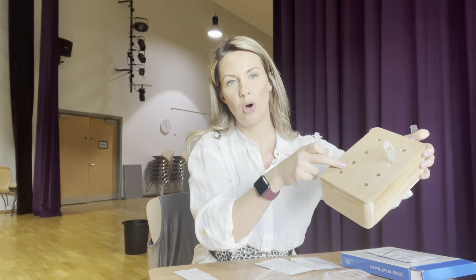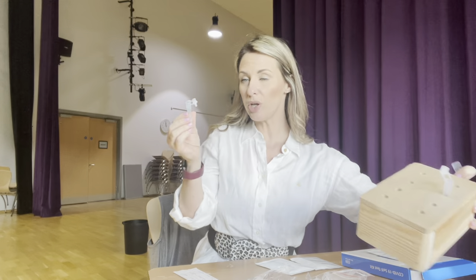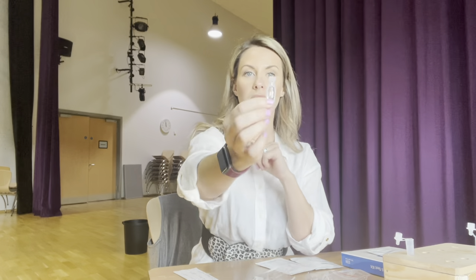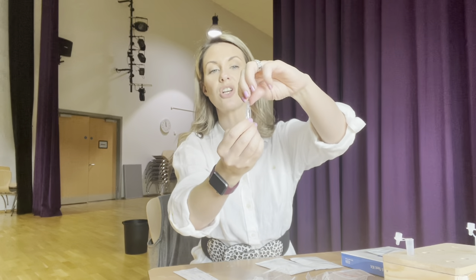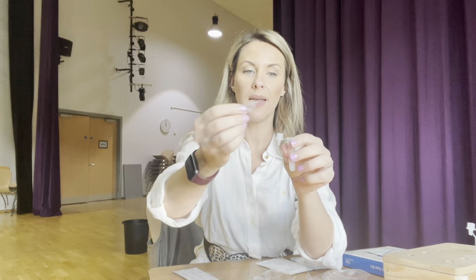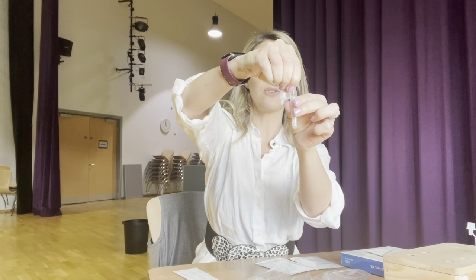You might want to ask somebody to help you with this, because if you don't have a device that you can pop your test tubes in, you're going to need somebody to hold it while you do the test. So you're going to take your extraction fluid, undo the top, and empty the contents into the test tube.